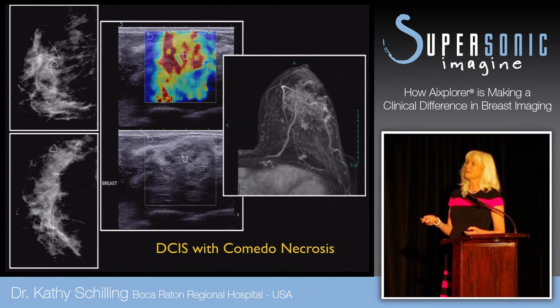This patient, dense breast tissue, she had a palpable mass. Nothing was seen on mammography. There was no calcifications, there was no mass, there was no distortion. We do ultrasound and we can see a poorly defined area of mixed echogenicity. Is this just dense fibrous breast tissue or is this something real? Is this something to be concerned about?